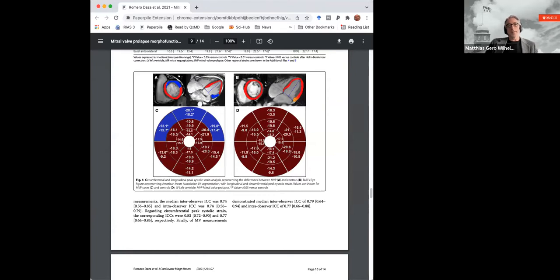because with mitral valve regurgitation, we know the challenge is that you may miss the point of no return, and it may then be too late to operate on mitral valve regurgitation. And CMR in general has made huge progress over the last years and is now more widely accepted as the actual standard for assessing the severity of mitral valve regurgitation, although echo is of course much easier to get. At least, I don't think it's easy to assess it with echo because of various reasons.